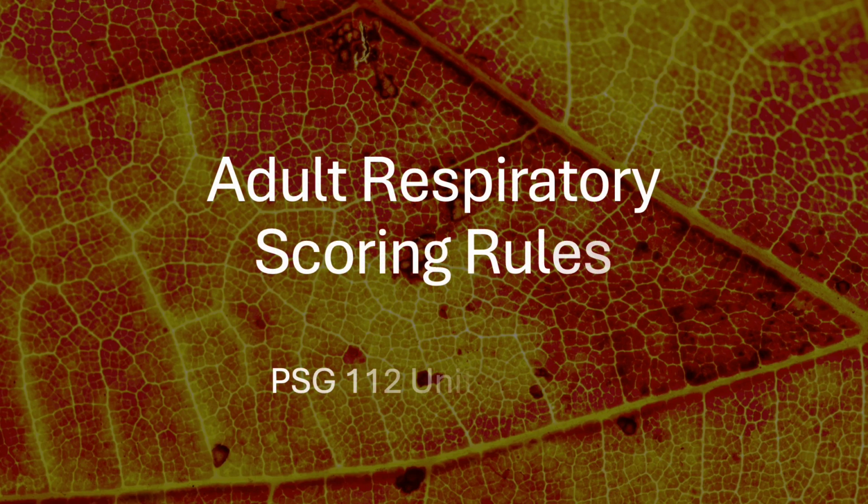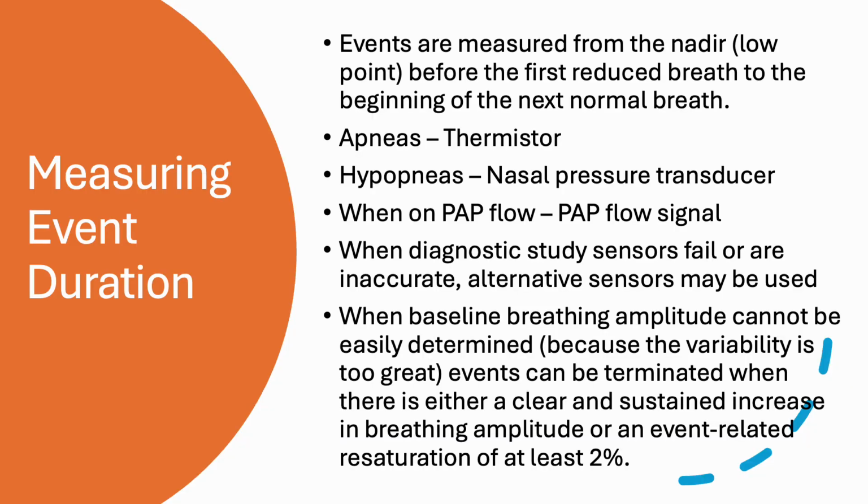All right, the last part of this unit will be all about scoring respiratory events. Let's talk about how to measure how long events are. And don't worry if you don't understand the words at first. I have an example to show you what I mean.